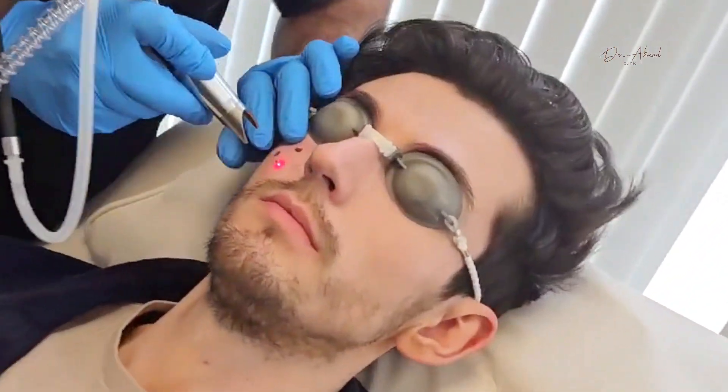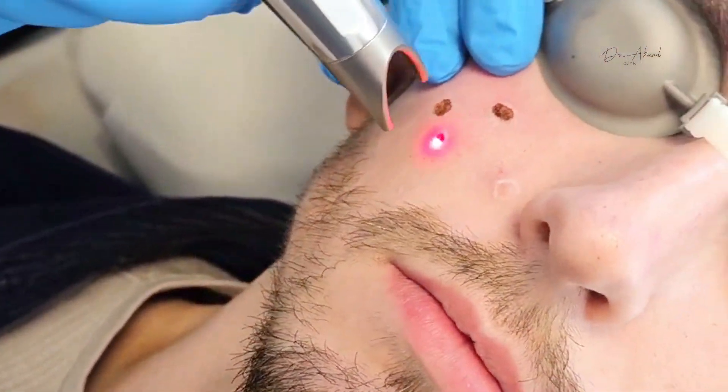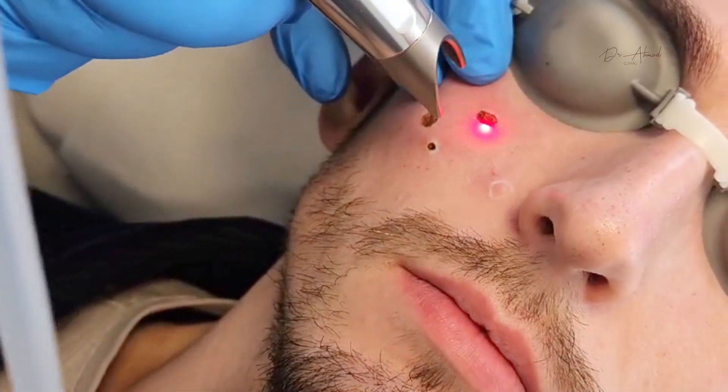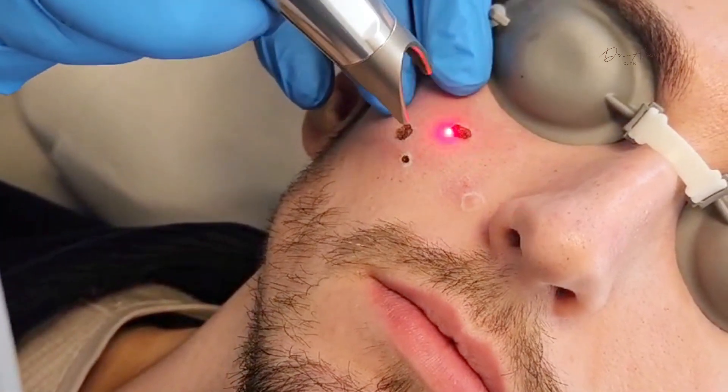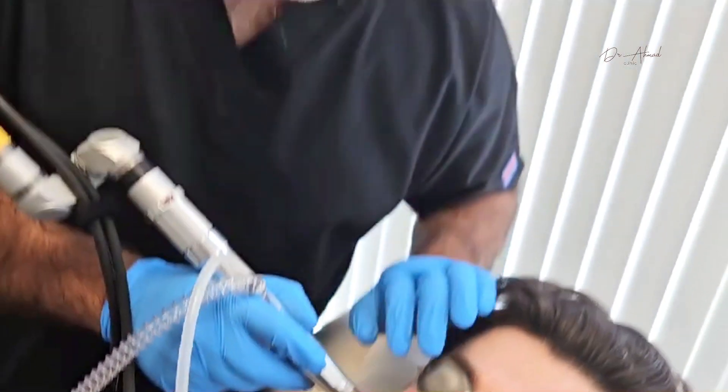As you can see, we've done three little lesions here already. That scabbing will fall off in seven to ten days, and what will happen is that new healthy skin will grow over and it'll be as if there wasn't anything there at all.